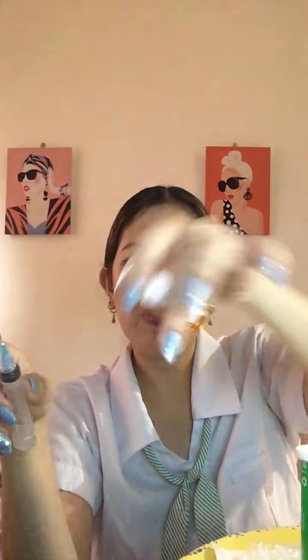Just be careful when you are removing the cap. Then insert the needle into the center of the ampule. It has to be at the center, but because we're using a vial, it's going to be a different story. So you have to insert it in the middle of the rubber. So, carefully place. The rationale for this is that when the ampule is inverted, solution does dribble out if the needle tip or shaft touches the rim of the ampule.